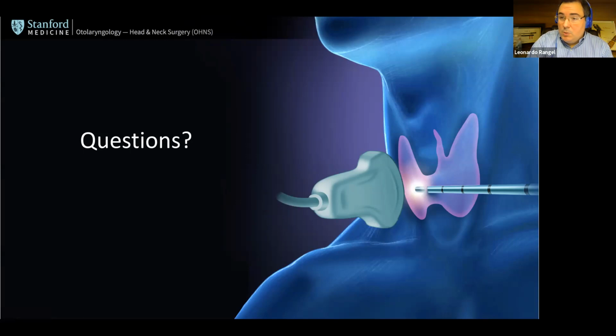For example, treating a patient with hypothyroidism and one huge nodule, we are not treating the thyroid, we're not preserving the function, we're just treating the volume and solving that nodule. That patient would not benefit the most from this procedure. So this kind of discussion is patient by patient.